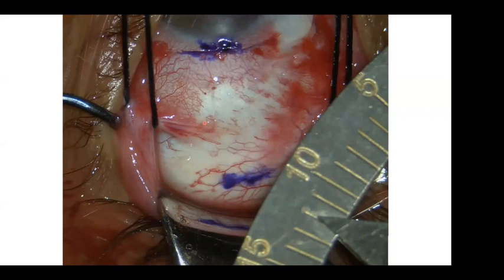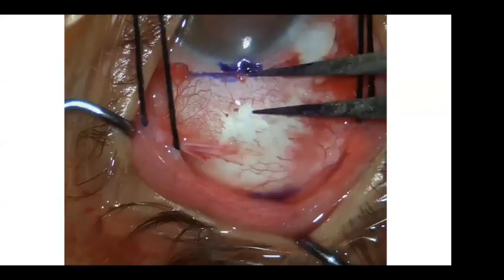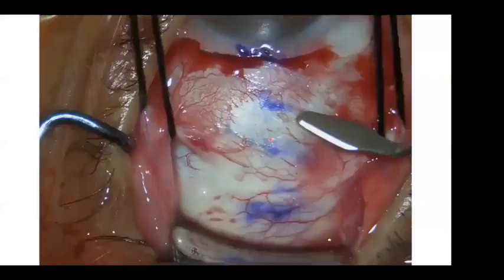Though it is technically difficult, the benefit of this procedure is quite good, and it has been an internationally accepted step. So I do an initial measurement of 12 millimeters, and then I divide this into 4 parts of 3 millimeters.